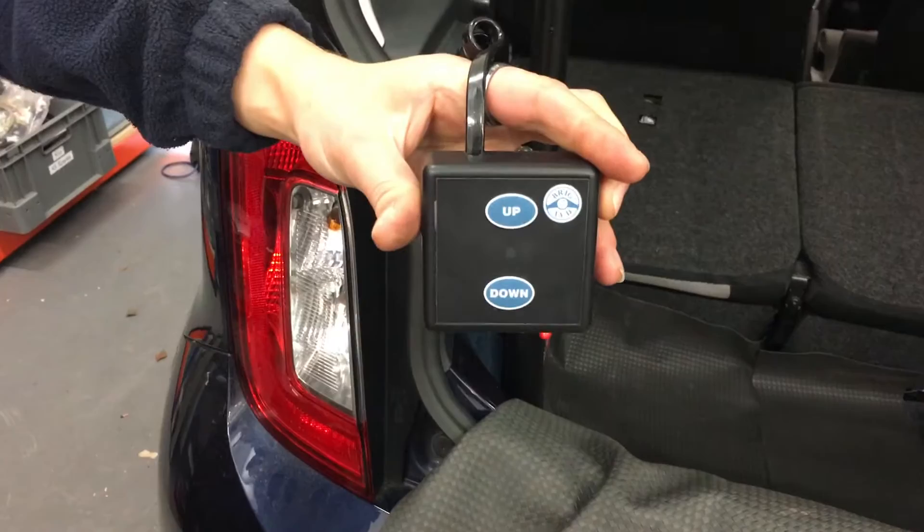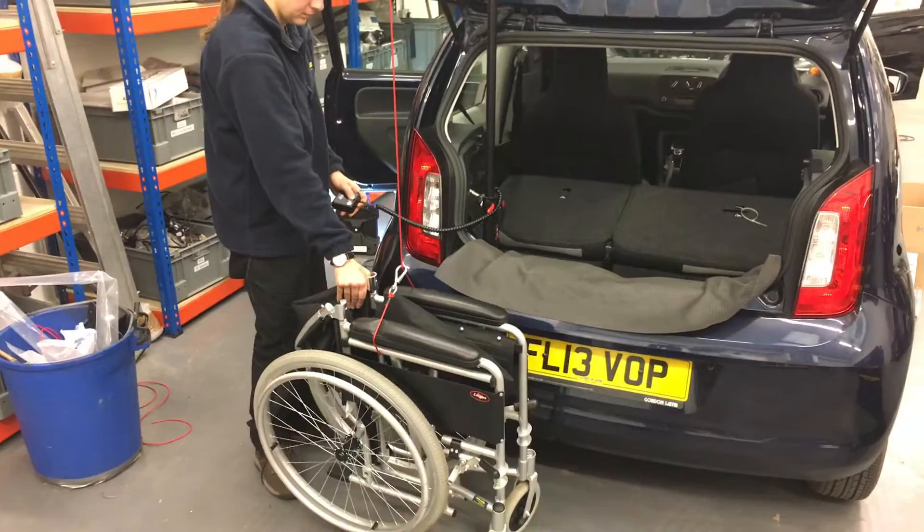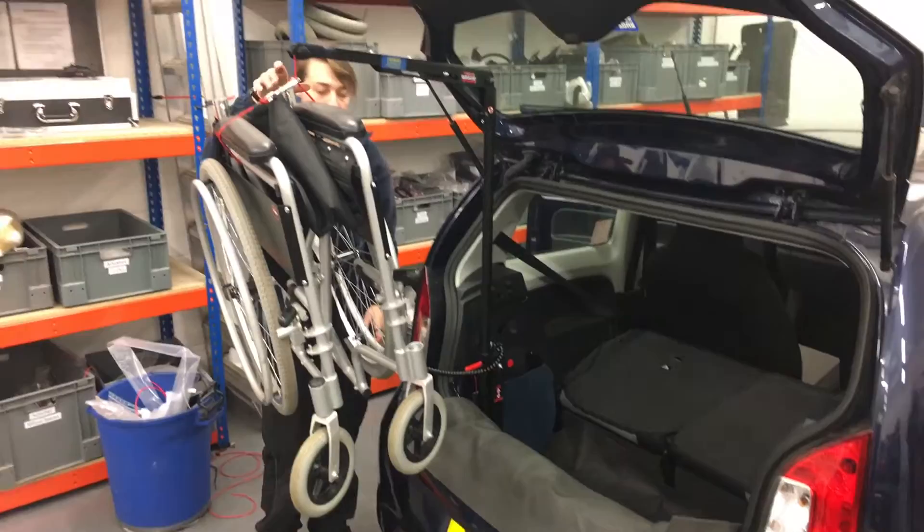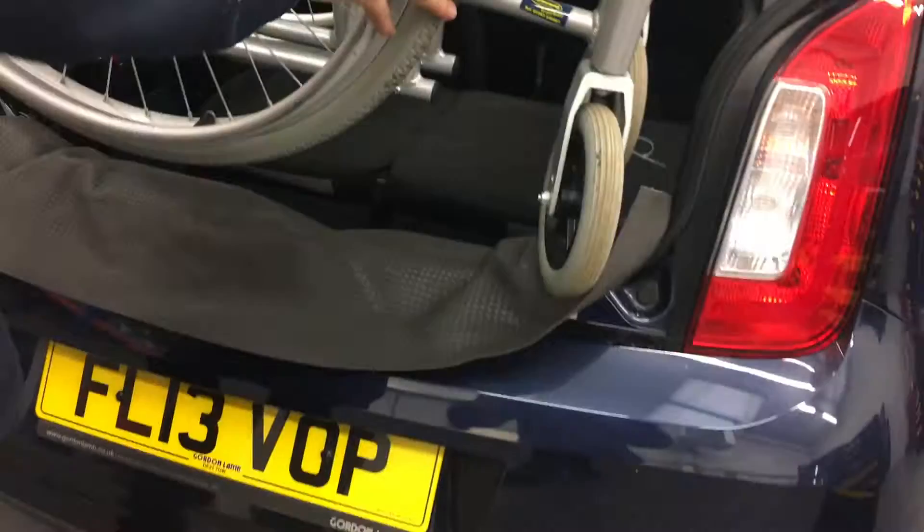We've got a remote control that's got up and down controls on it. You can see that's lifting level. Get it up close to the top so we've got enough height to lift the chair over the sill of the car.